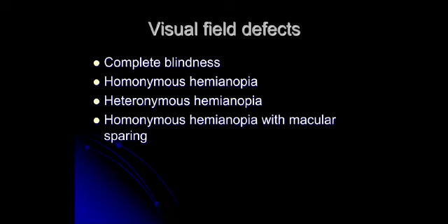As soon as a diabetic patient comes, we usually do fields. It is called fields. So you come to know different field defects, whether it is due to complete blindness, heteronymous, homonymous, or homonymous with macular sparing.